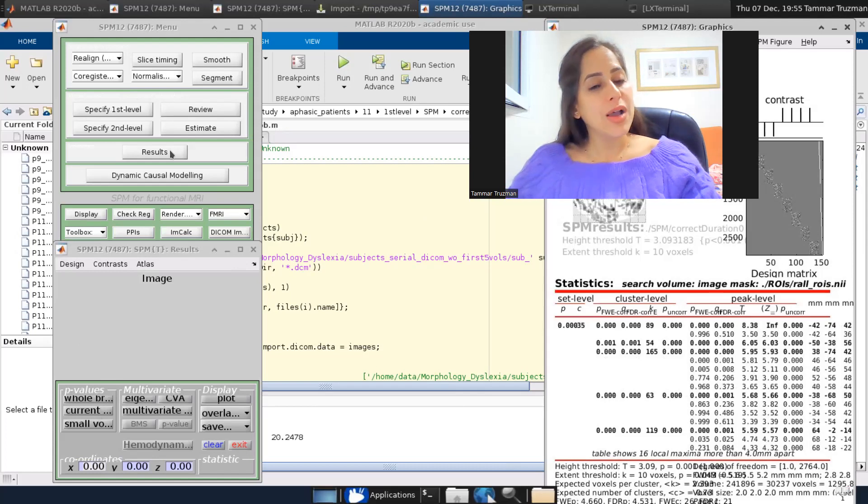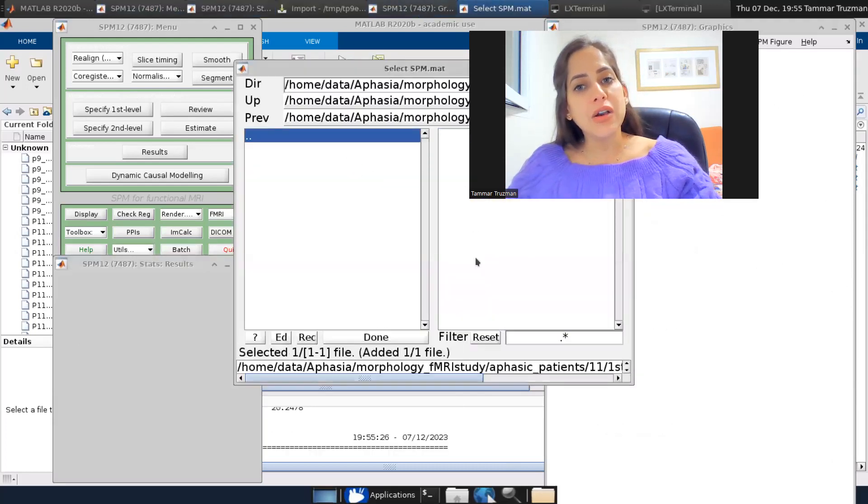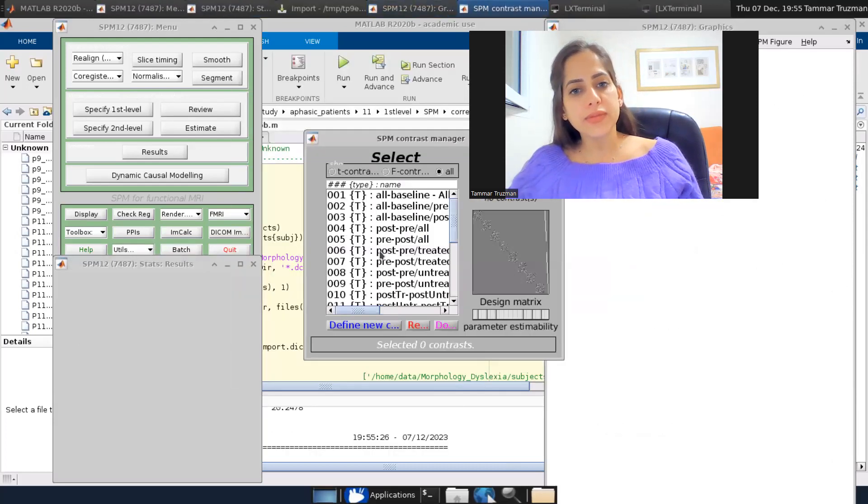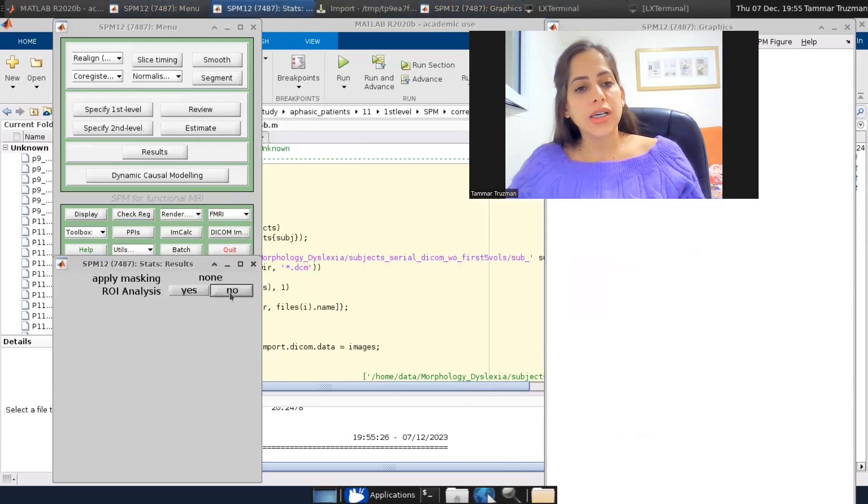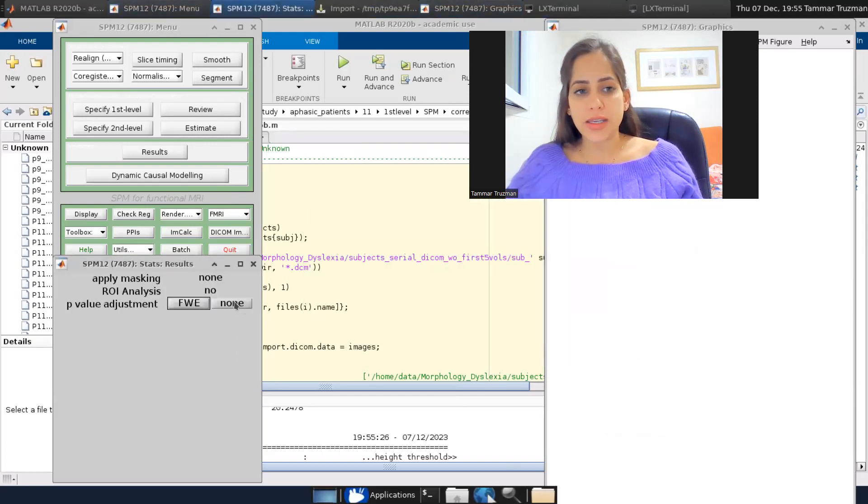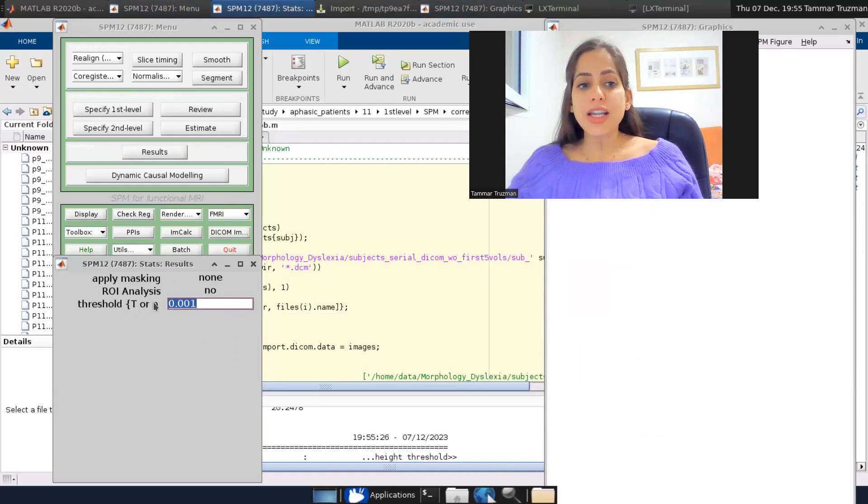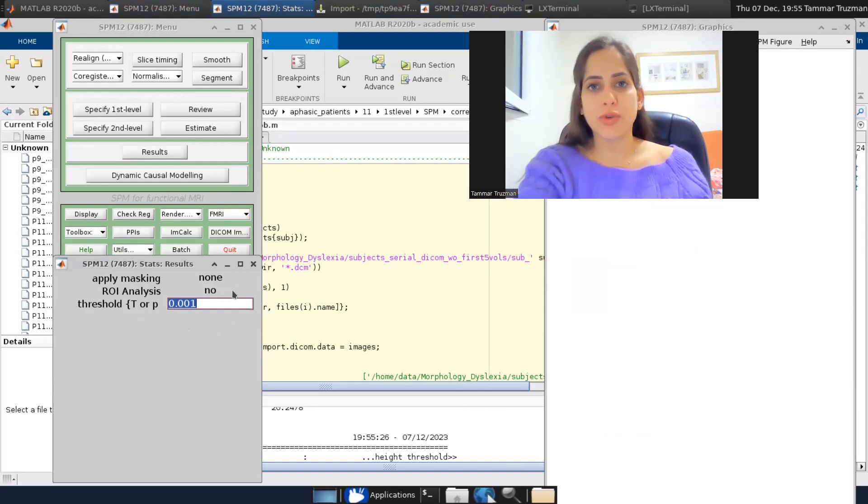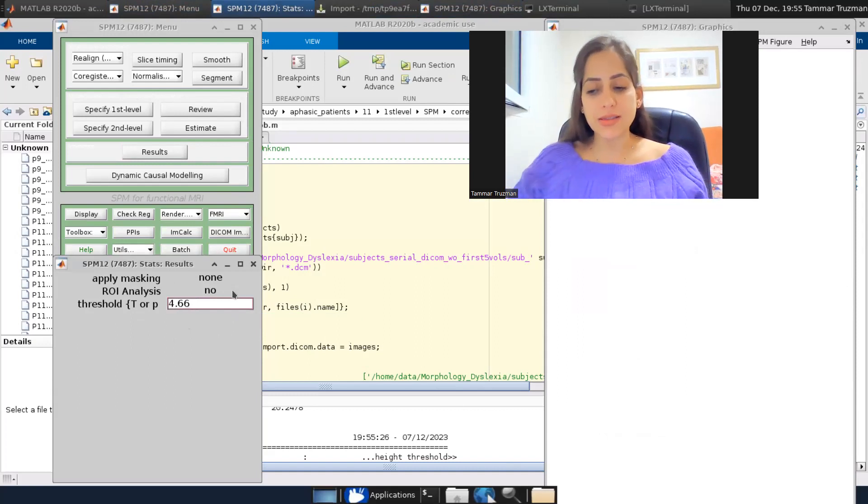So I'm going to load my contrast again. And at this point, I'm not correcting for anything, no p value adjustment. But here, I choose a T value that I found before. So my T will be 4.66.